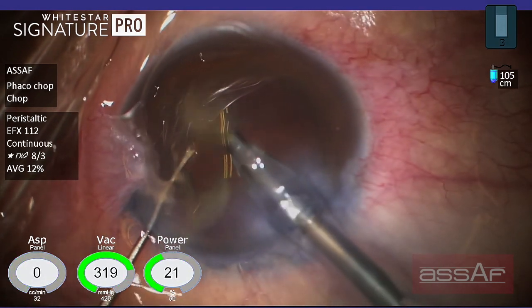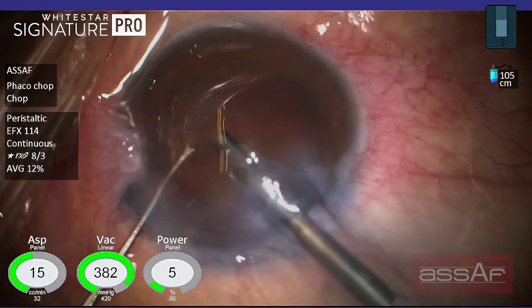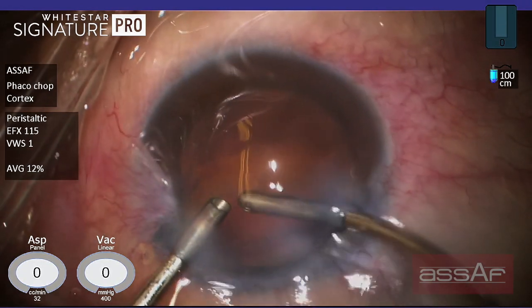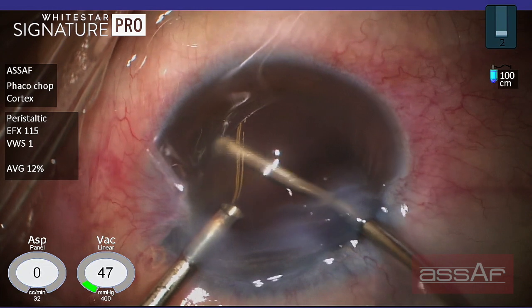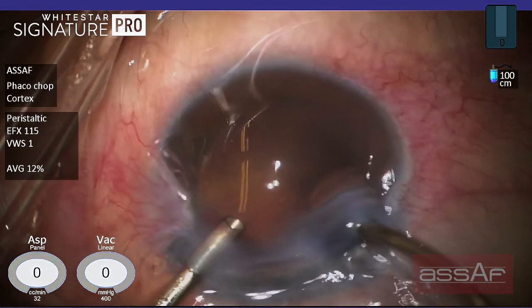The issue here is to elevate the isthmus away from the posterior capsule by the second instrument and attack this isthmus, trying to free each quadrant and emulsify it. We have now done with the emulsification of this large nucleus, and as expected only a few cortical fibers are left within the lens capsule in these hard cases.